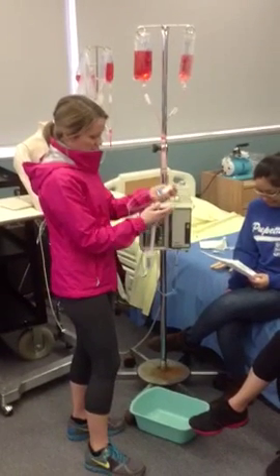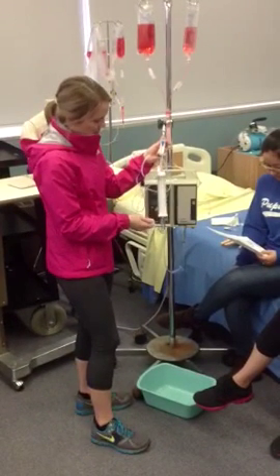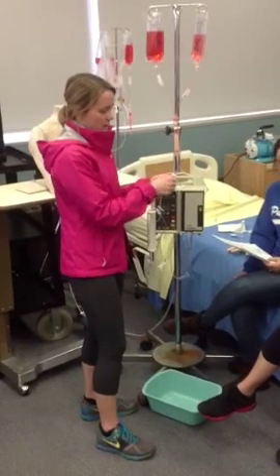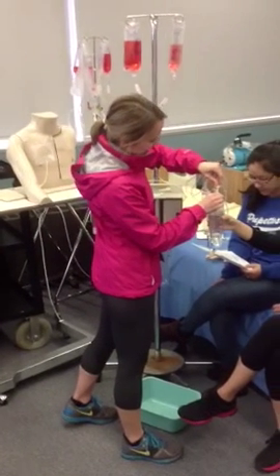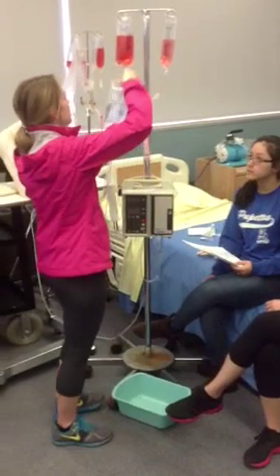We're going to take this out of the package and clamp everything up. Then take the cap off of here and this off of here, and we're going to poke it and hook this baby up.